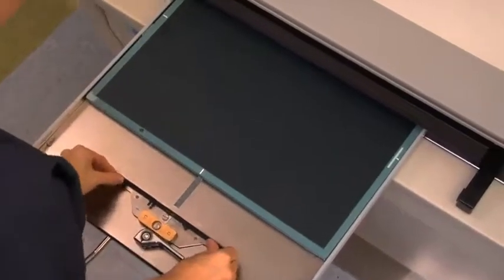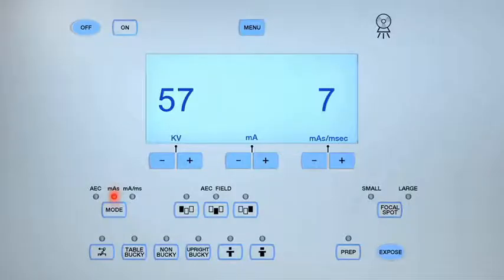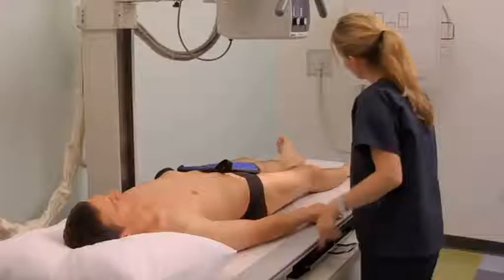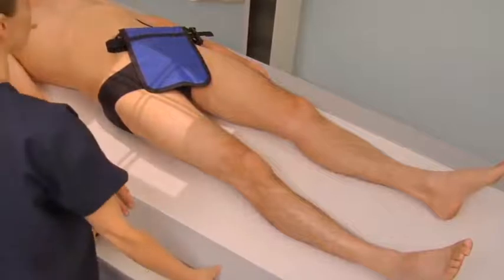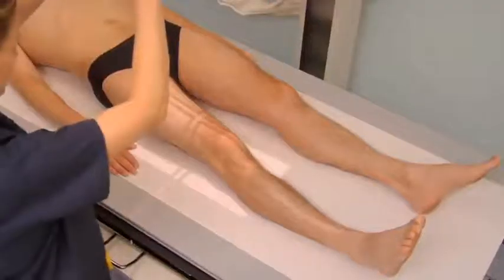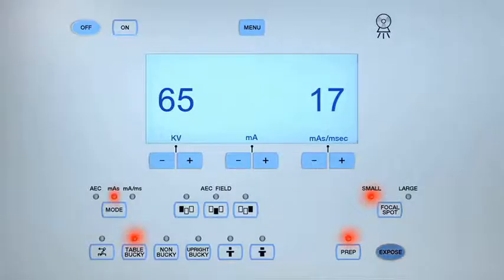Obtain an AP mid and distal femur projection by selecting a 14 by 17 inch cassette oriented lengthwise in the table bucky. Align the central ray perpendicular to the center of the image receptor. Select the table bucky and small focal spot setting on the control panel. Set the KV between 65 to 70 and MAS to 16 to 20. Place a protective shield over the patient's reproductive organs and rotate their affected leg and foot medially. Align the lower femur to the center of the image receptor with the knee joint positioned two inches above the lower border of the image receptor. Set the central ray to the mid shaft of the femur to include the knee joint. Collimate to include the mid to distal femur, knee joint, and soft tissue structures. Expose the cassette.